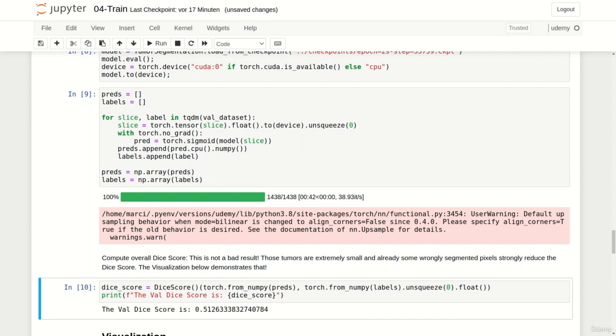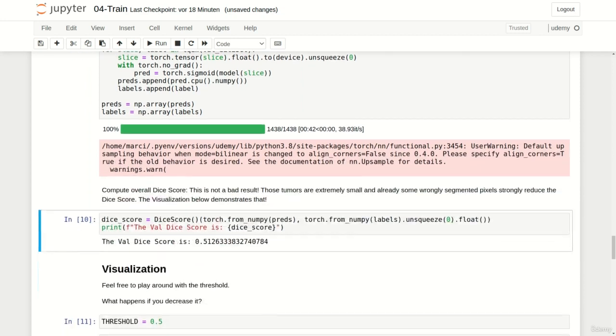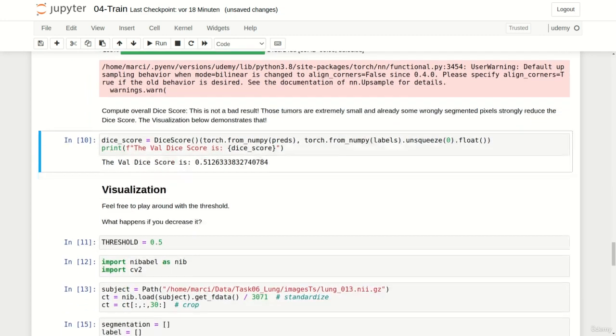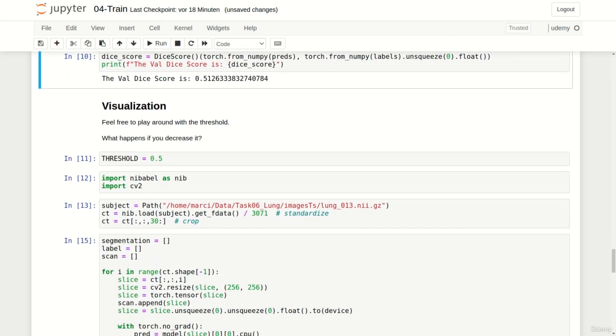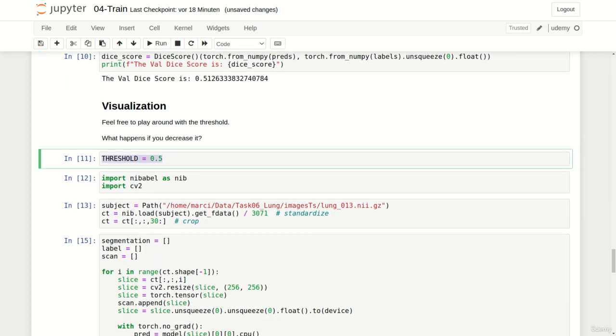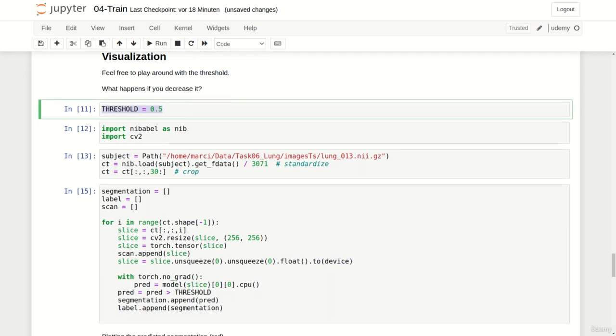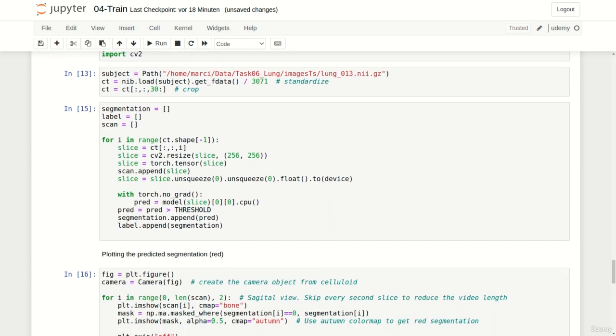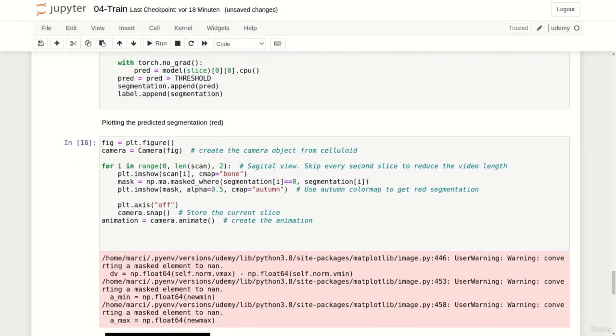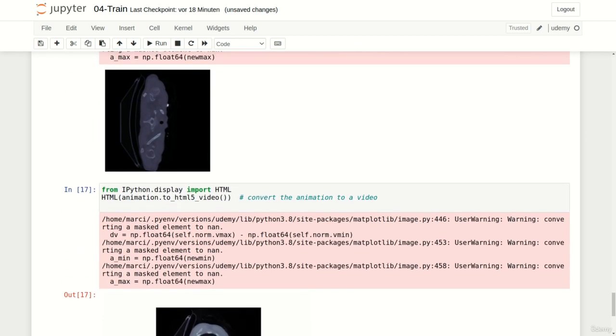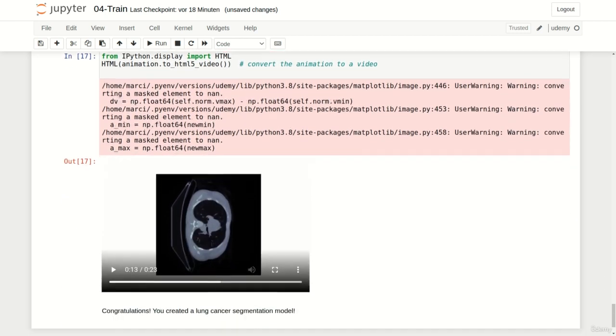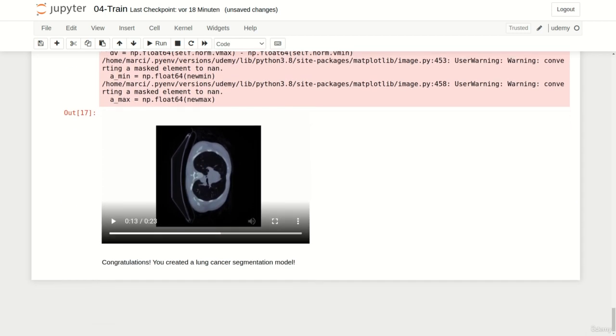Let's have a look at the final visualization which further supports this statement. Please feel free to change this threshold here to observe what happens. All right let's have a look at the predicted segmentation. Note that I already fast forwarded the video a little bit to spare you some time.